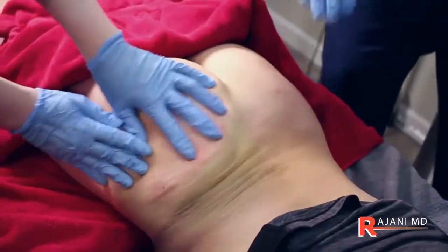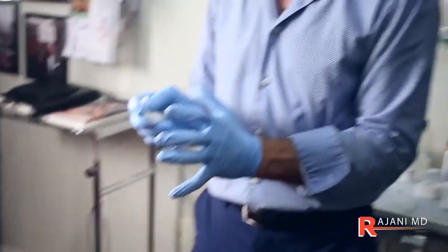Now, you want to massage. So I recommend that patients do their own massage here, and I recommend 2 to 3 times a day for 7 to 14 days. Because remember, Sculptra goes in as a water, we're dispersing that around. So what we want to do is have that water with the Sculptra beads dispersed in the fat layers, also superficially, to give a super smooth surface that everyone is after these days.